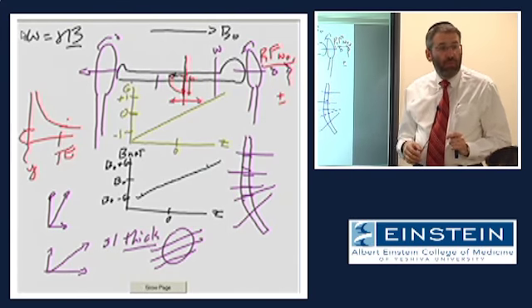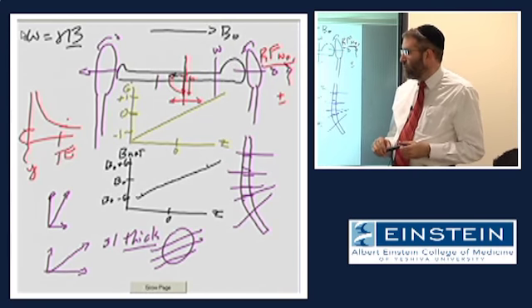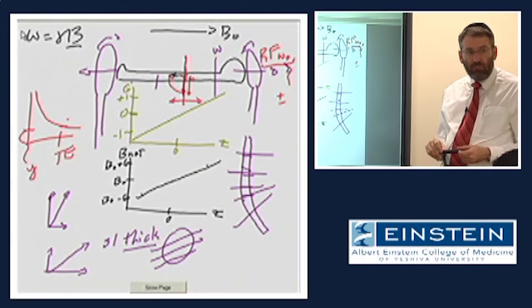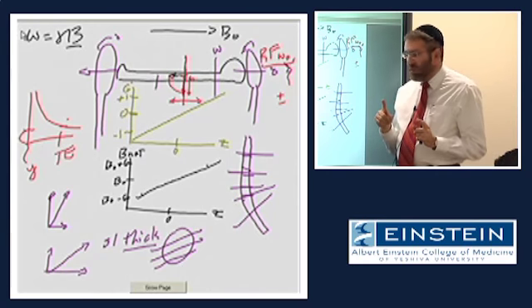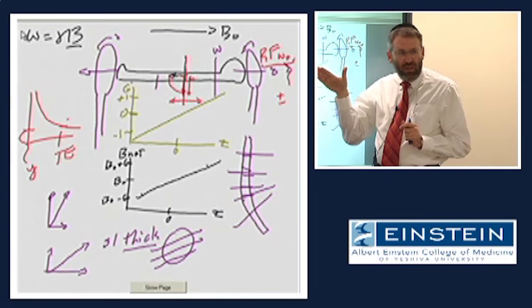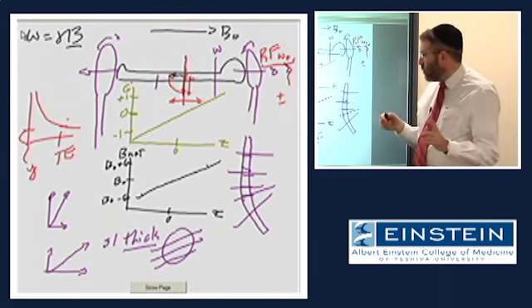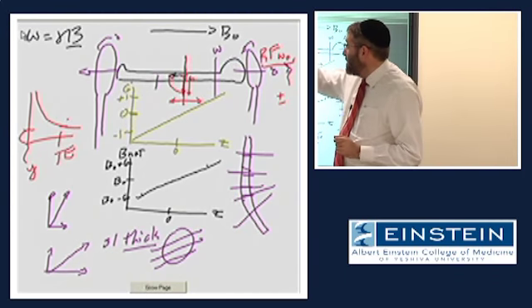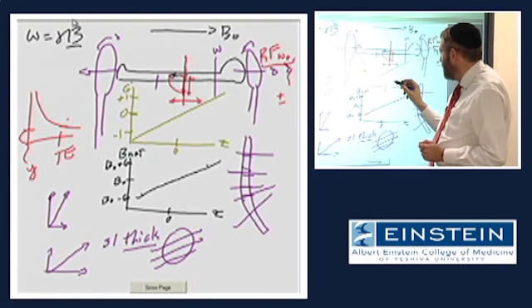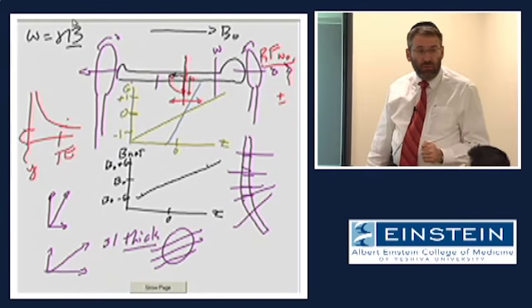I'm sorry, speak up. Can you modify the angle of the gradient magnetic field? The angle of the gradient magnetic field. Like if you stick in that angle but you keep the range the same, then... So this may be semantics, but not angle, because angle to me means the orientation of the gradient magnetic field, which would mean perhaps turning on multiple gradient magnetic fields. But I think what you're meaning to say is that we could change what we typically call the strength, or we might call the slope of that gradient magnetic field.